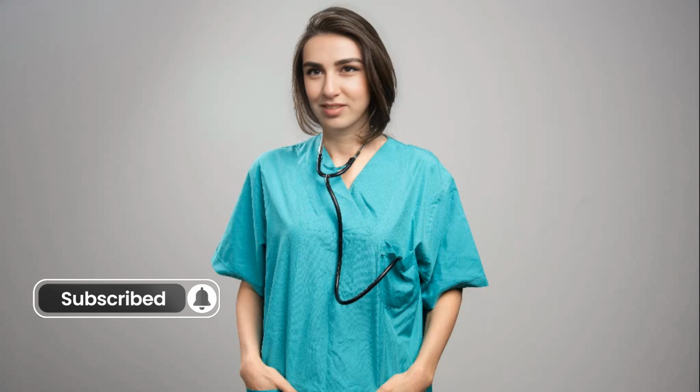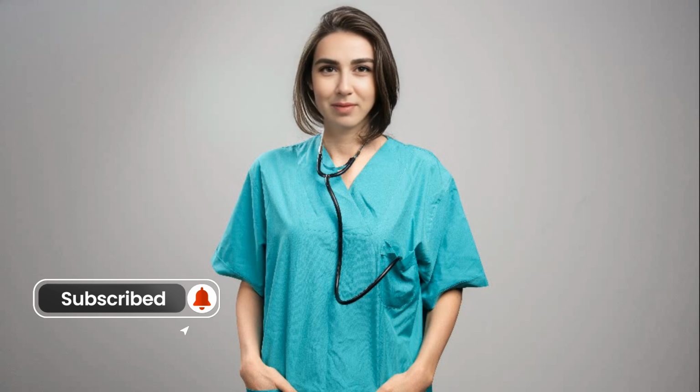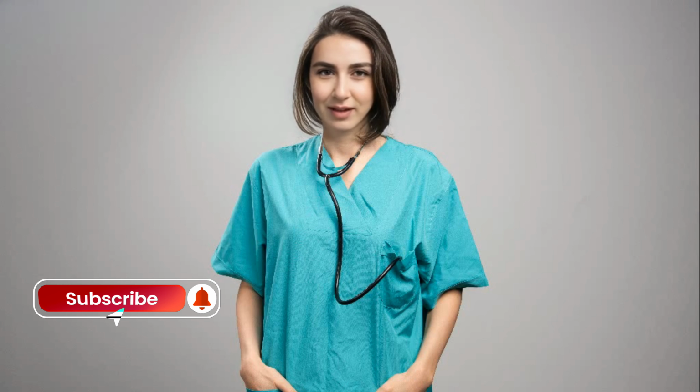2. Angioplasty, restoring blood flow in narrowed arteries. Purpose: angioplasty, often performed after angiography confirms a blockage, is a treatment that opens up narrowed or blocked arteries, particularly in the heart. It is often combined with stent placement to keep the artery open long-term.